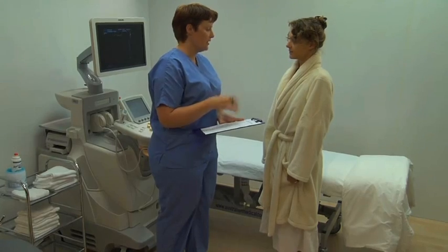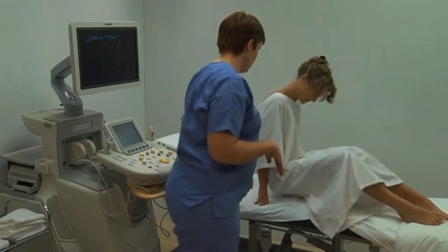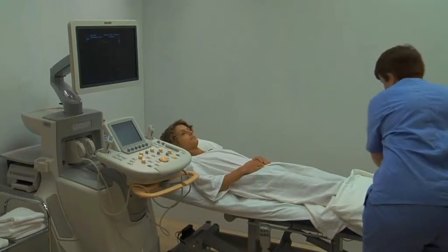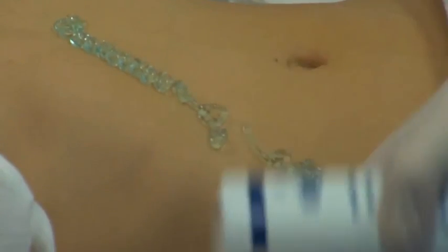Ensure that the patient is well hydrated and has a full bladder. Explain the technique of breath holding during the scan. Ask the patient to lie supine on the bed and make them comfortable with the use of pillows or wedges, positioned as required. Expose the patient's abdomen and apply pre-warmed acoustic gel to the upper abdomen.